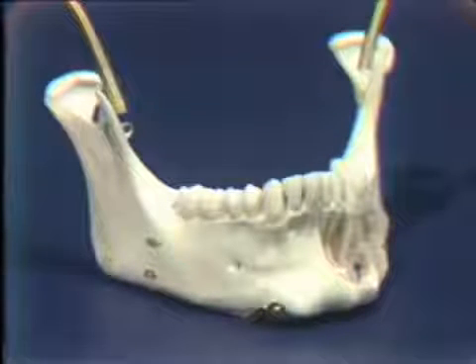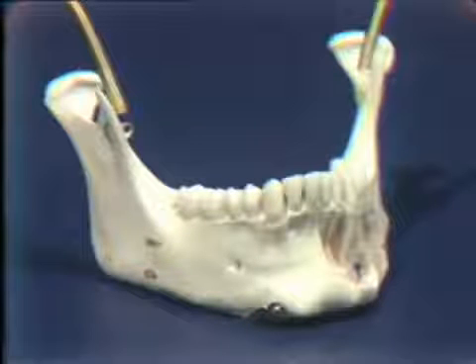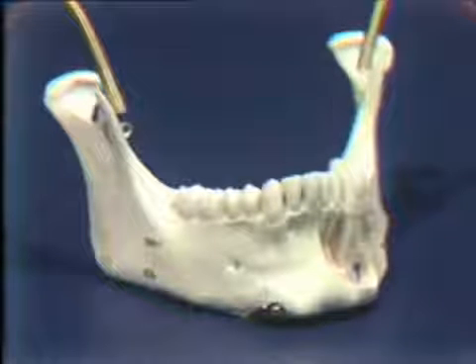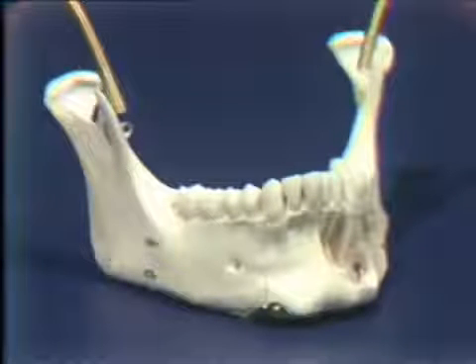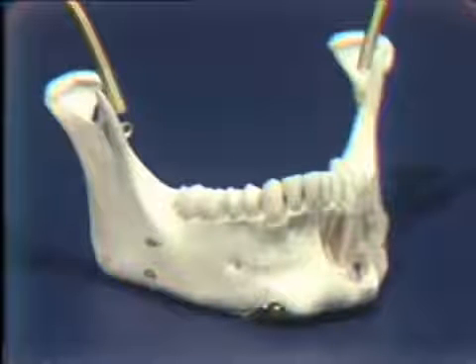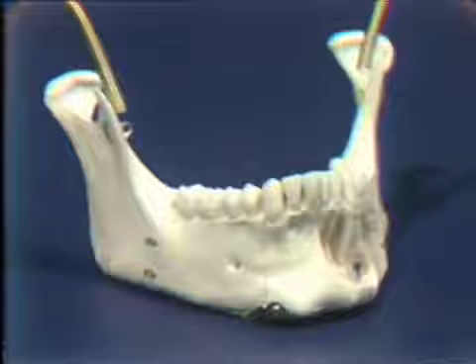Now let us remember that in giving the long buccal injection, in contrast to having the patient open as widely as they possibly can for the inferior alveolar block, it is better to have them open slightly, halfway, so that the cheek can be retracted. You have good access and vision, and this also creates tension in the soft tissues of the vestibule so that the needle bevel can be passed through them easily, causing very little, if any, discomfort.